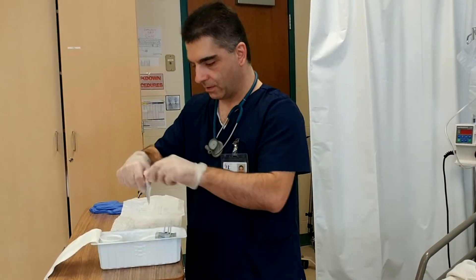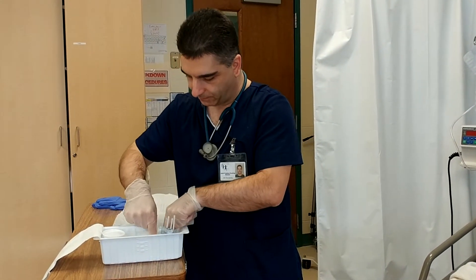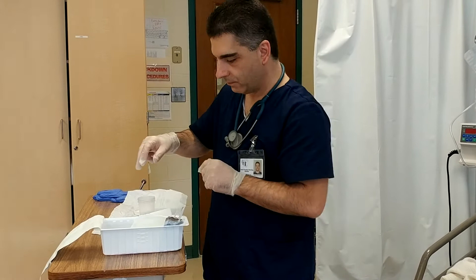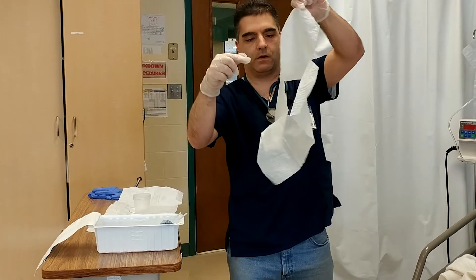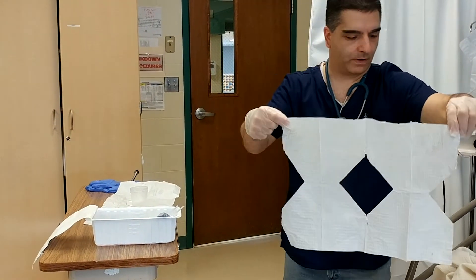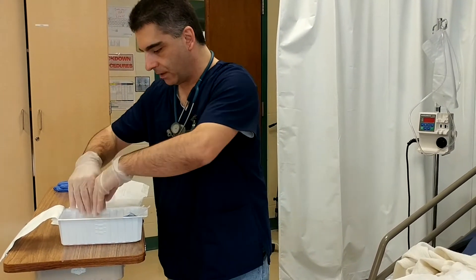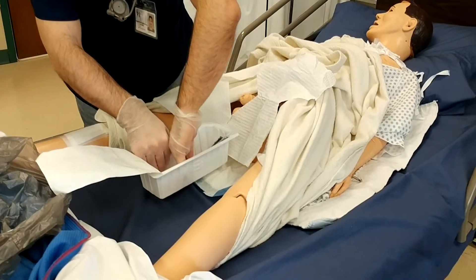I've got lube in here. I'm going to open that and put it right on the tray there, throw that away. So now I have my little specimen cup — take that out, get the cap off. Now I'm going to grab my drape. Grab it however it falls. That's going to have to be good for now. So now I'm going to bring my whole tray down there. Since we're all ready, grab the inside where it's sterile and bring it down, moving closer to the patient.